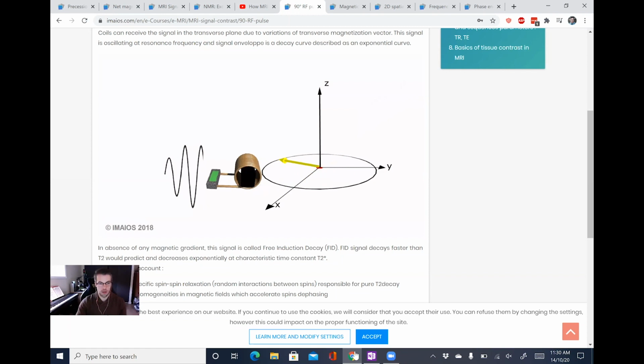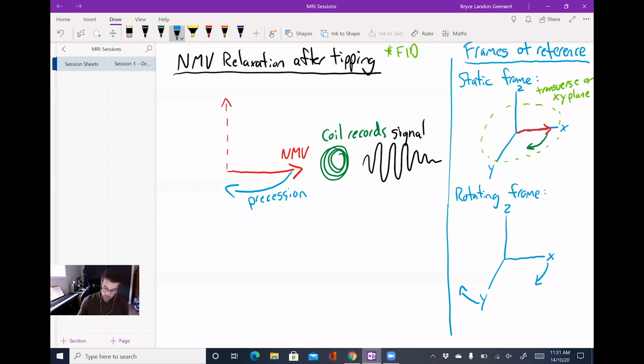So that can be described by a curve. I'll just let this play one more time. So we see that at first the regrowth is fairly quick, and then once it gets larger, the vector grows more slowly. All right, cool. So that can be described by this little graph that I'm going to draw here. We'll make the axes black, I guess.